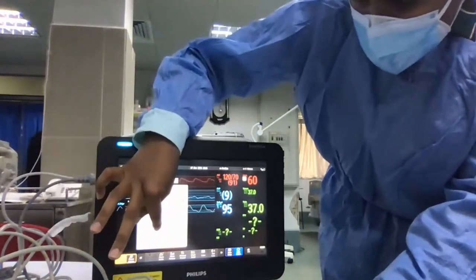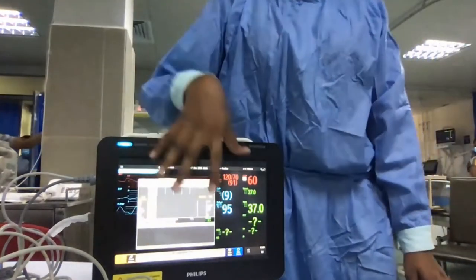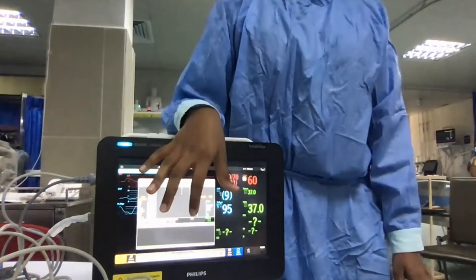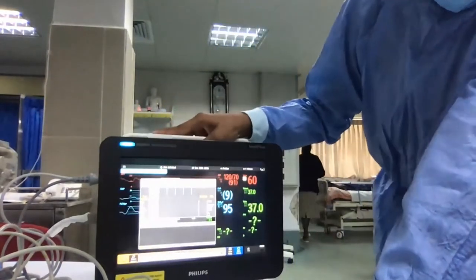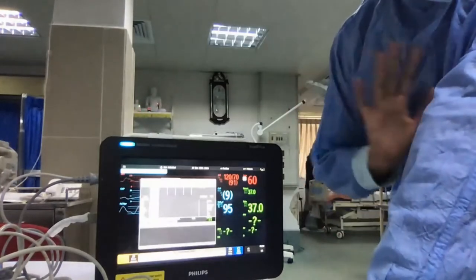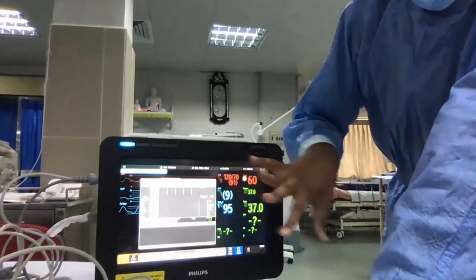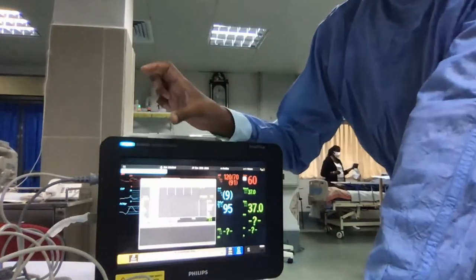Just click on cardiac output and you will get the cardiac output screen. Calibration window, actually. This is the calibration window. So here, I forgot to tell you one thing. Before anything like this, first of all, we have to insert the patient's details to the monitor.